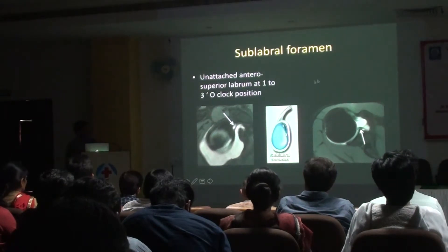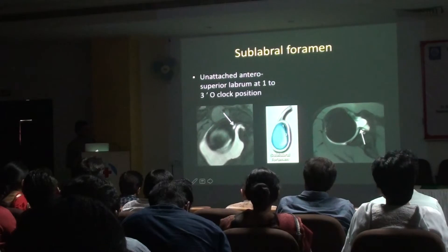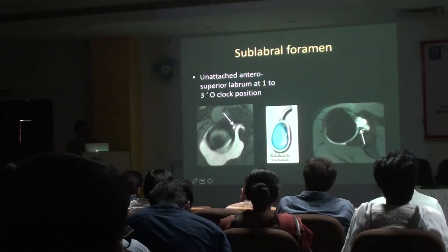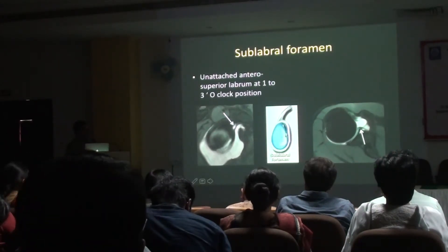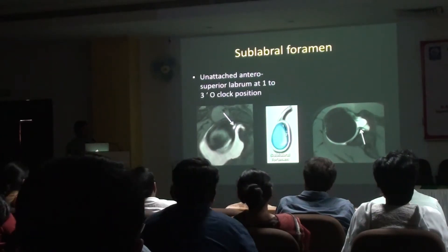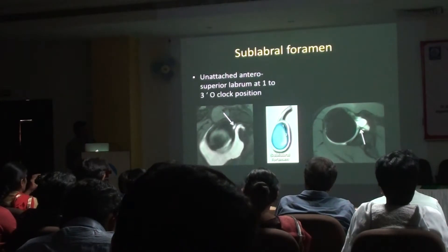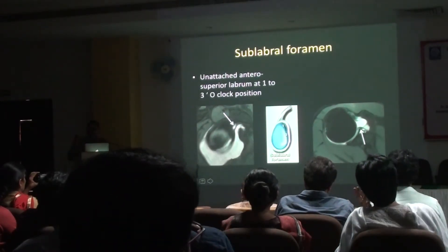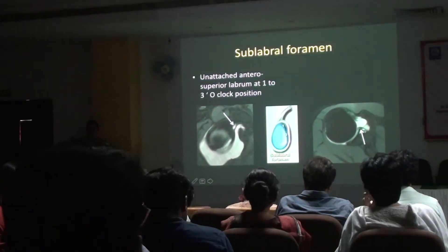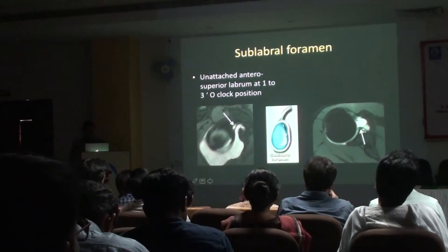The second normal variant is the sublabral foramen, seen at 1 to 2 o'clock position antero-superiorly — you always see a small foramen through which contrast seeps. Don't call it a tear. Anything antero-superior, think 100 times before labeling it as a tear.